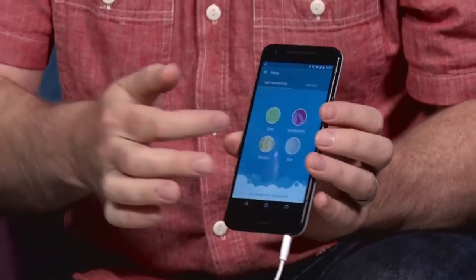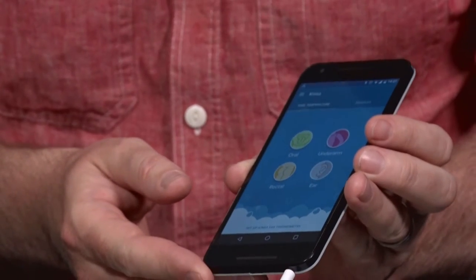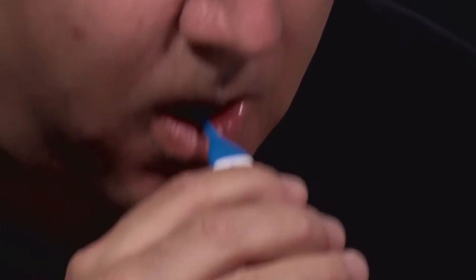Let's do a quick demonstration just to show how simple this is to take a temperature. You've got your profile loaded — and you choose which body part you're going to use. You've got a few options here: we're going to probably do the oral, but you could also do the ear, the underarm, or of course there's the rectal. I'll do the mouth.